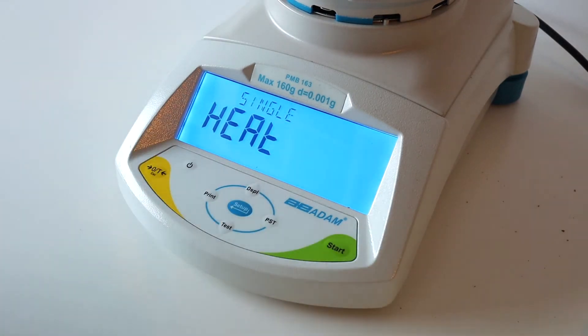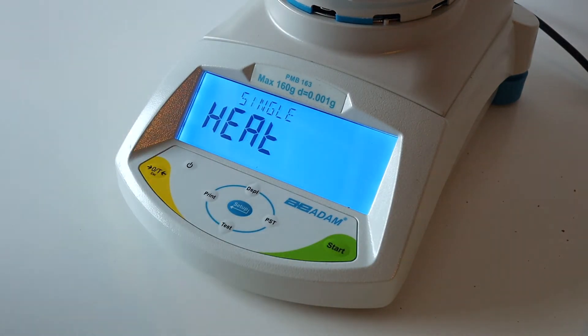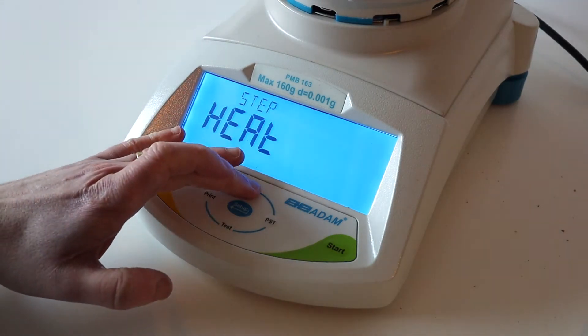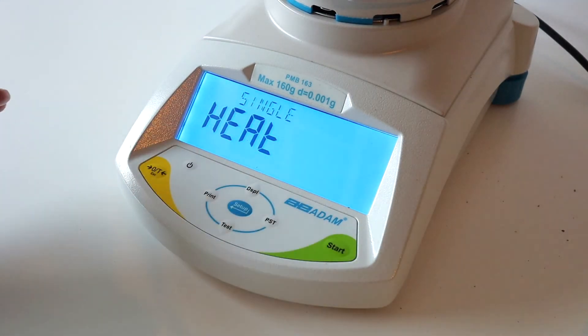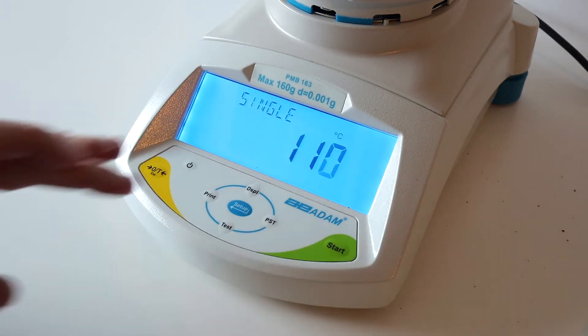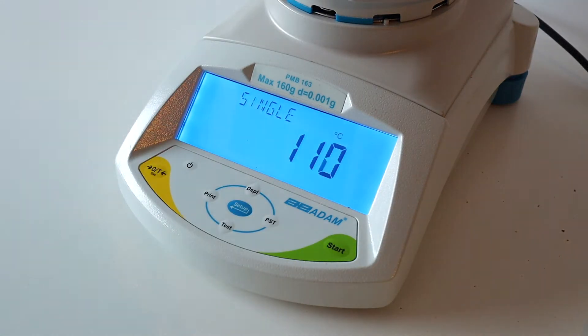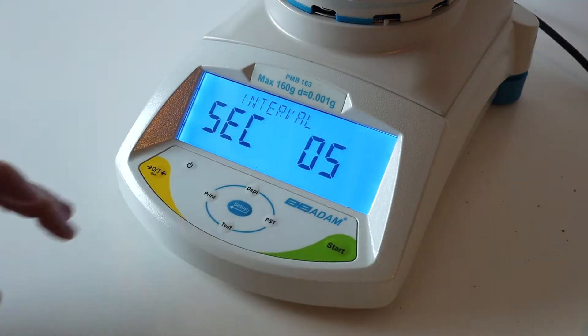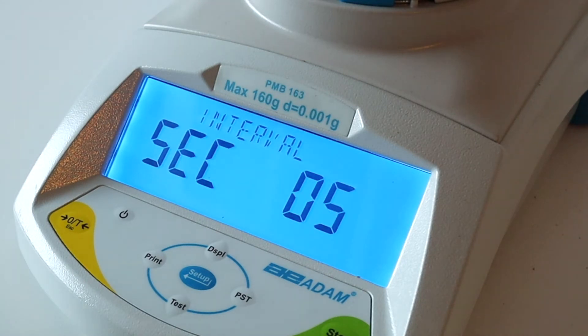Next, choose how to heat your sample. You can scroll through the options using the Test button. The majority of applications use the single option. Press Setup. Select the temperature. We recommend starting with no more than 110 degrees.